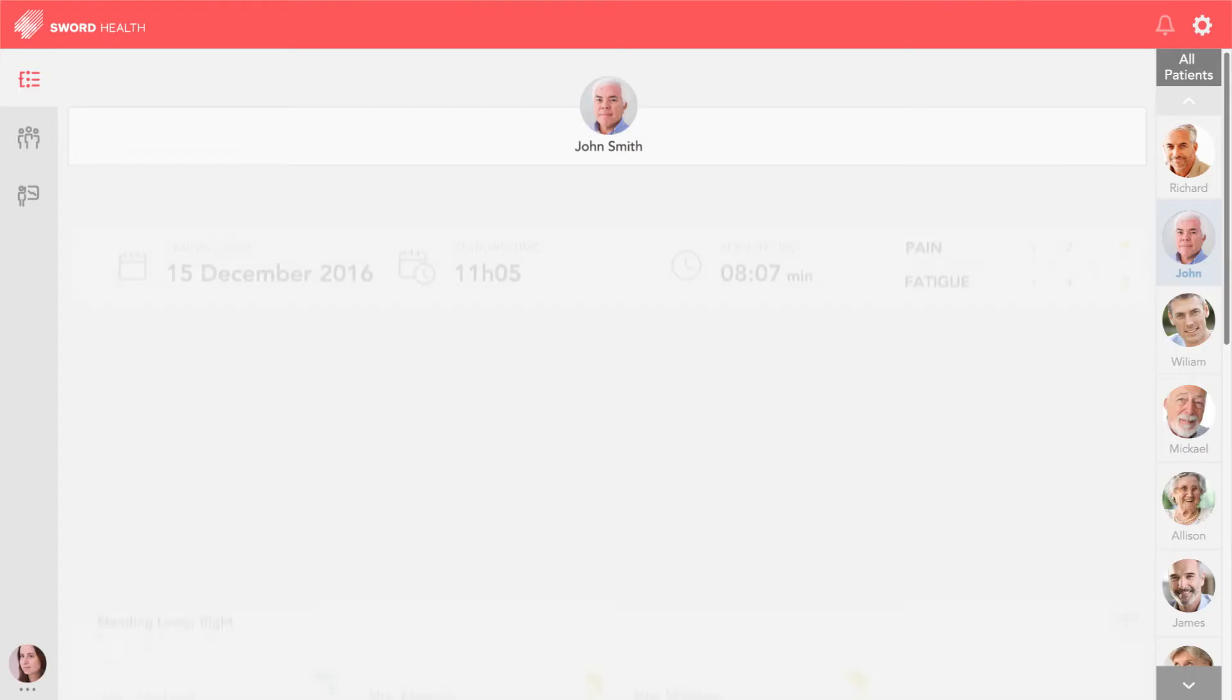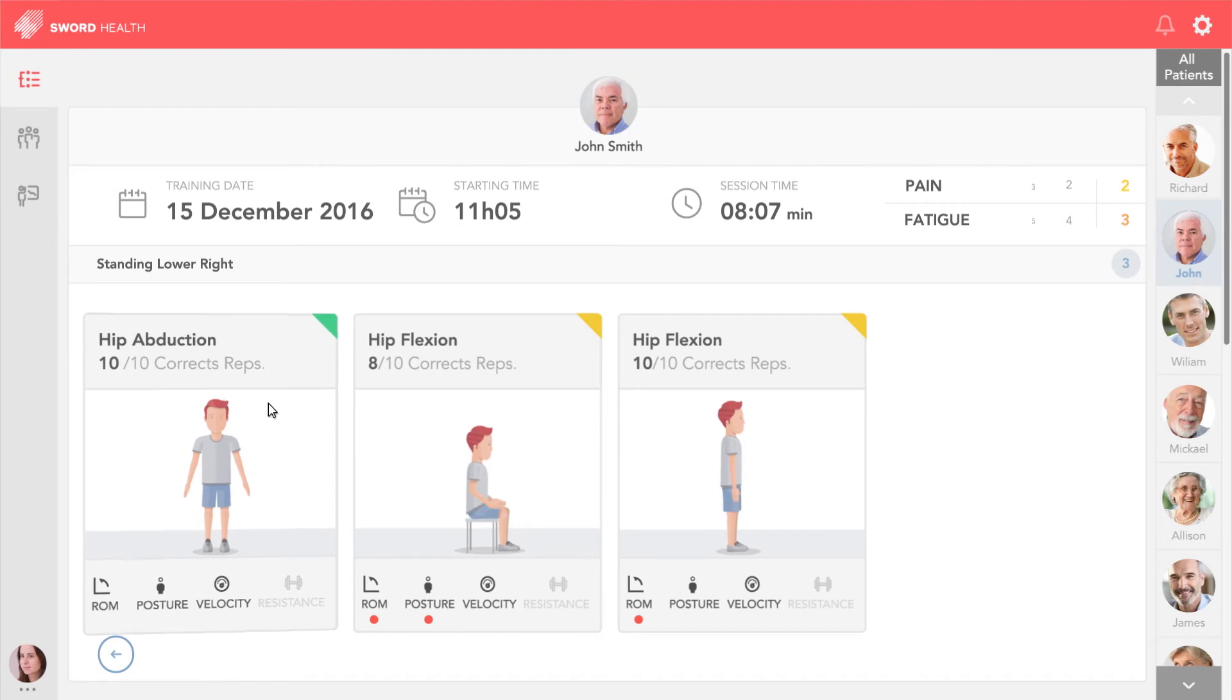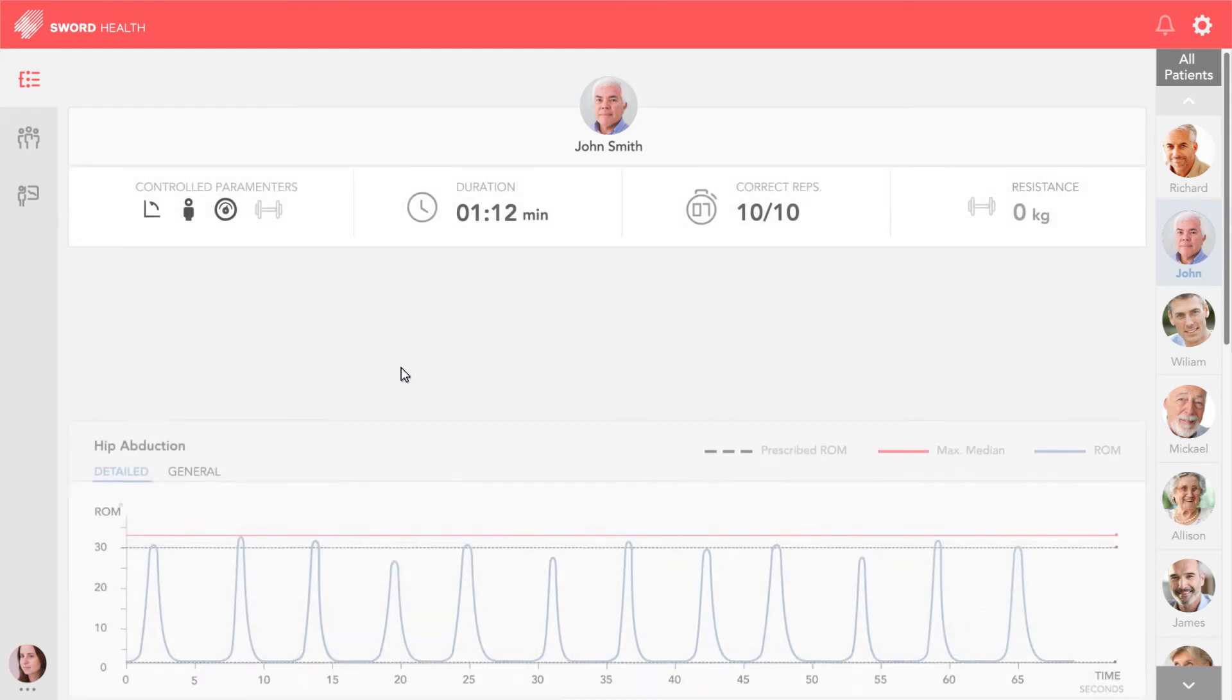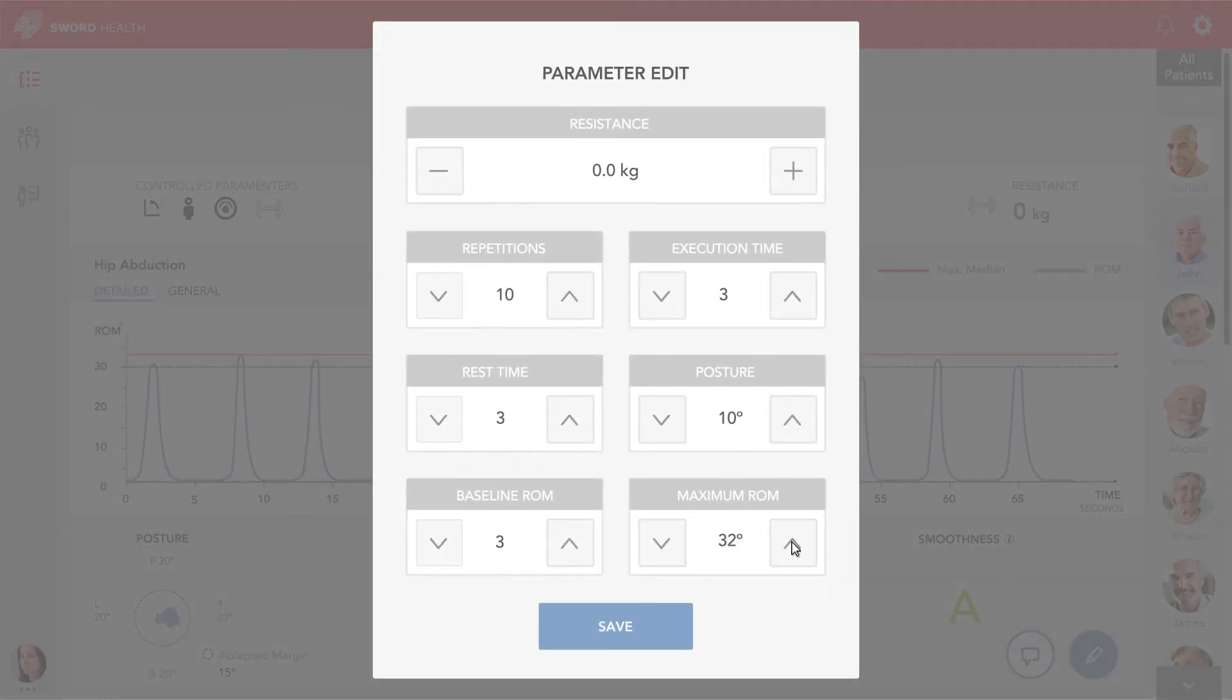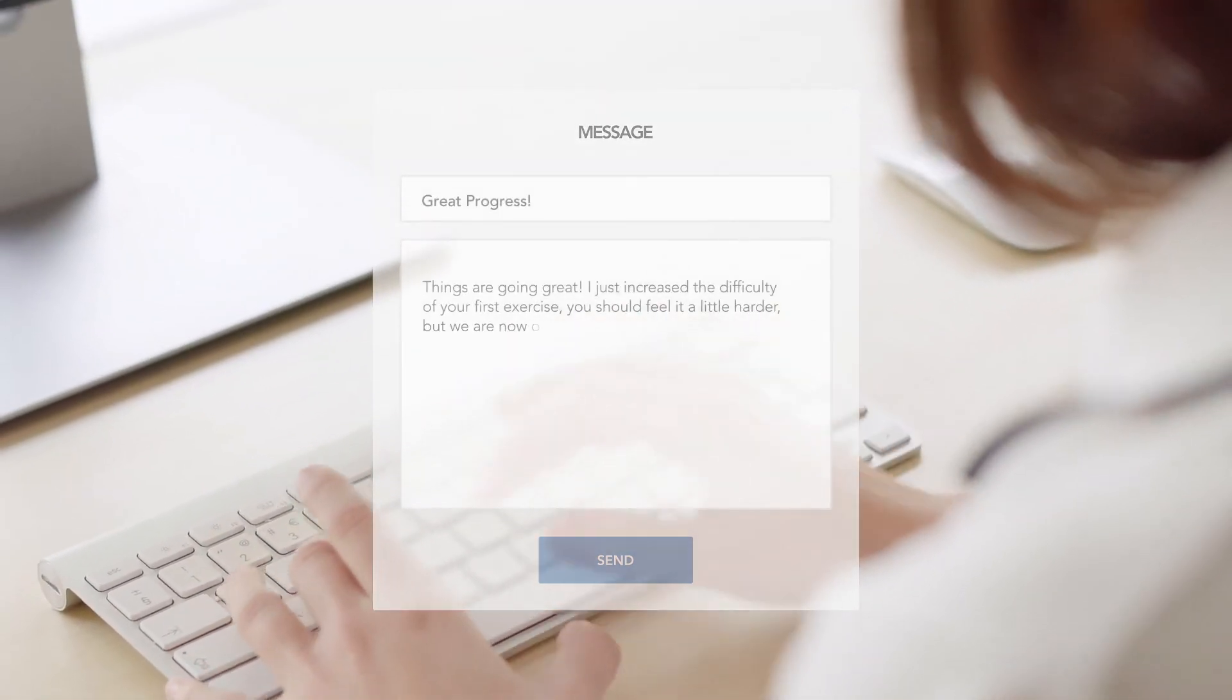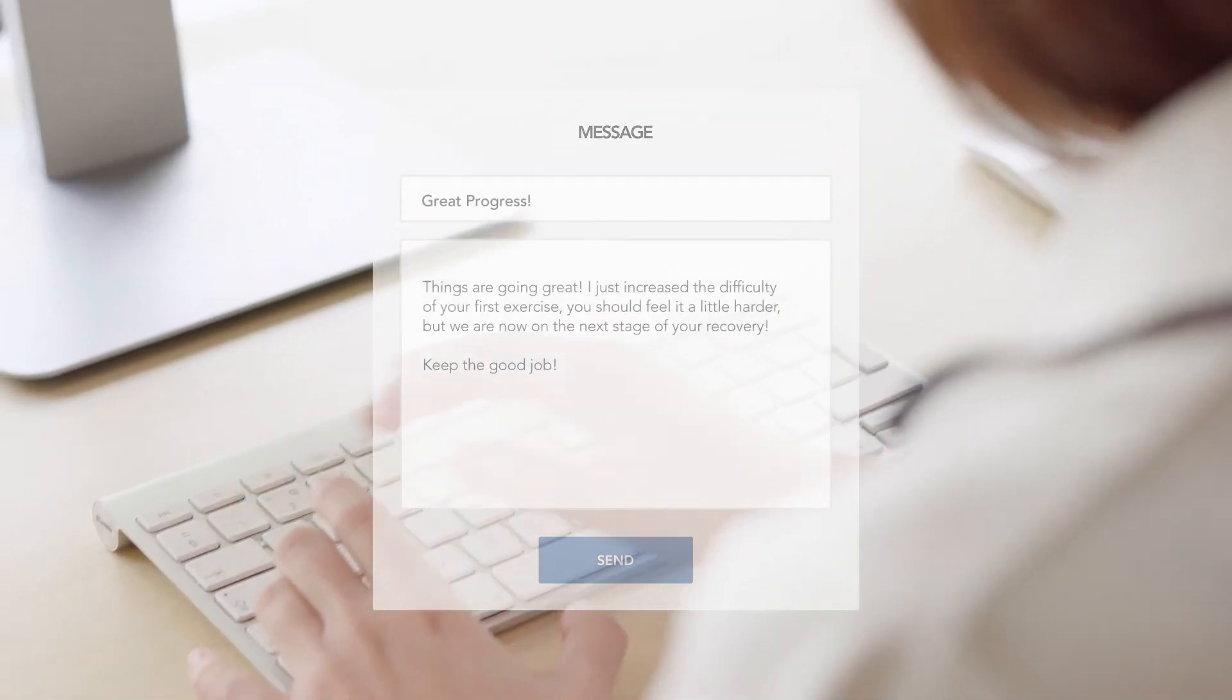SwordPhoenix allows the therapist to monitor each session remotely with access to every detail. This way, he can adjust each exercise based on the patient's performance, as well as send messages to congratulate new achievements or correct errors.